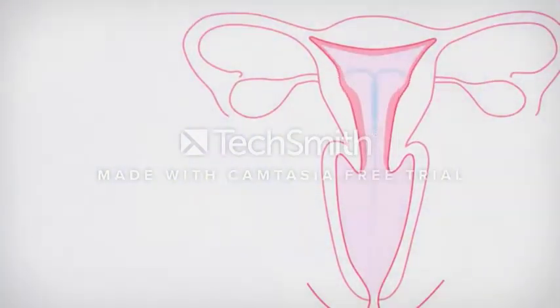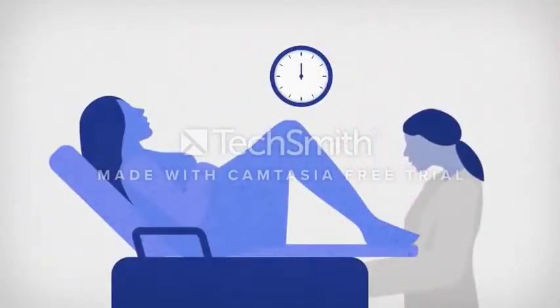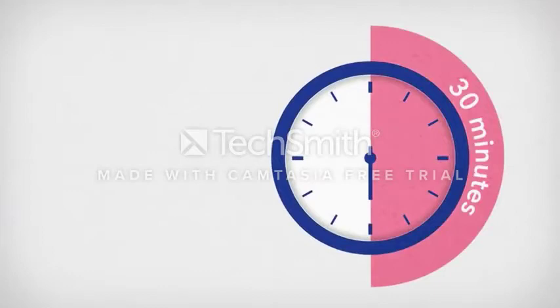The IUD or Mirena is then fitted into the womb and we will cut the threads of the device so that they sit high up inside the vagina. The procedure can be uncomfortable, but half of women experience little or no pain and local anaesthetic can be used. The whole appointment usually lasts around 30 minutes.